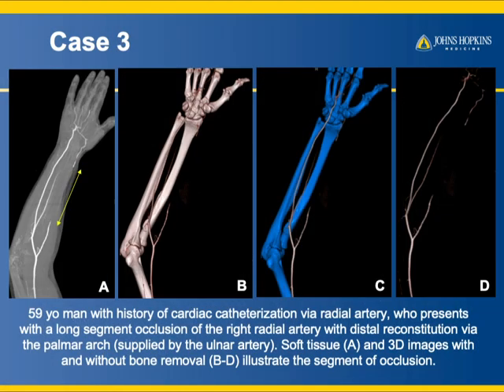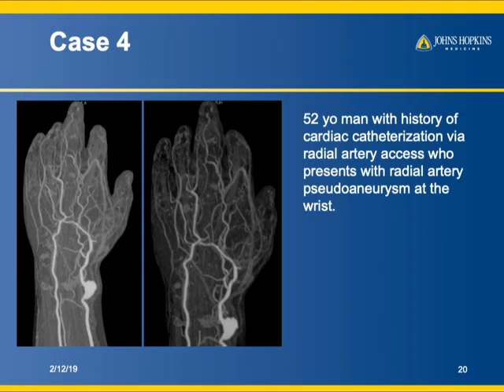Another case: a patient who had cardiac cath via the radial artery now shows a long segment occlusion of the right radial artery with distal reconstitution in the palm of the arch — not artifact, not motion, simply vessel occlusion. With all bones removed, another patient demonstrates a beautiful example of a radial artery pseudoaneurysm in the wrist. Every step from acquiring to processing the images is critical.